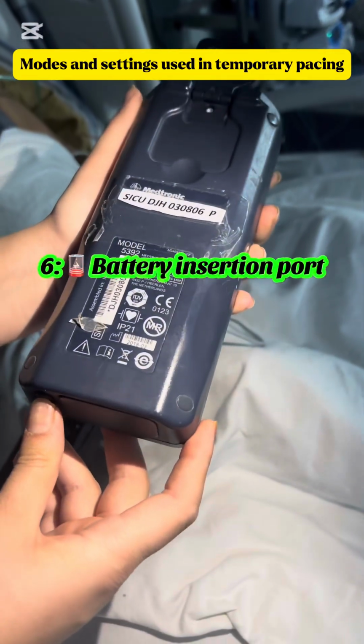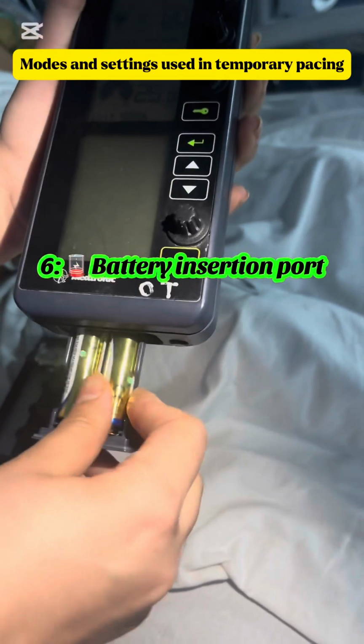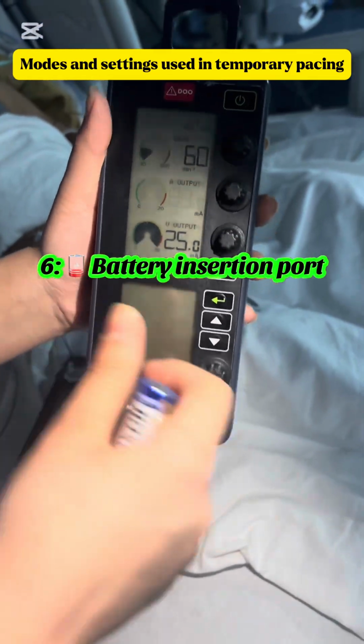And at the bottom of the pacing box, there is a button, so just press it to open the battery drawer, and the batteries are inserted by seeing the polarity marking on the inside of the battery drawer, as you can also see in the video.